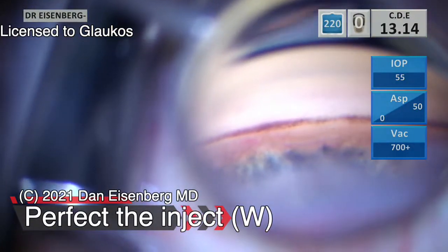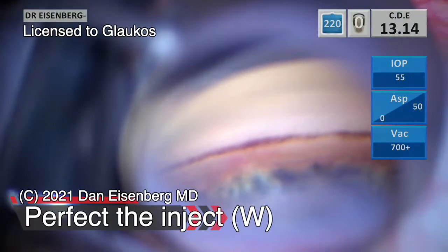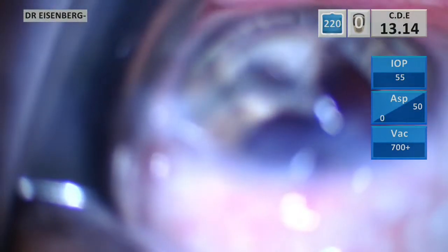Welcome to this Glaucos edition of the iStent Inject W MicroStent. I wanted to highlight a couple features that I find really useful.